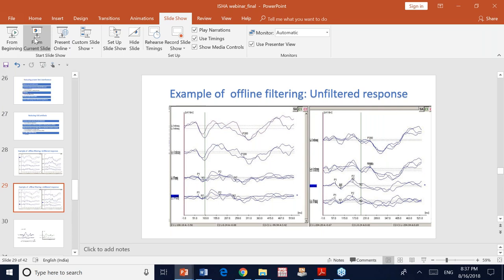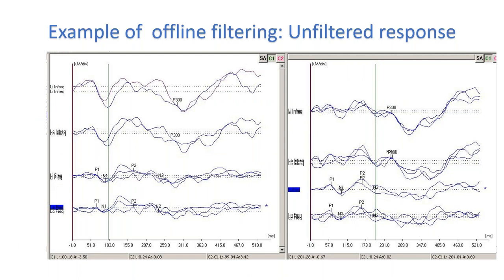Ma'am, what should be taken care of in case of tele-ABR? In tele-ABR, the patient is in one setup and the tester is in a different setup, which we are connecting through the internet or any of the tele-modes. So there isn't anything extra for the physiological artifacts to be controlled. It is basically the electrical interference which needs to be controlled. But the physiological artifacts will remain the same whether you're doing a tele-ABR or face-to-face evoked potentials.